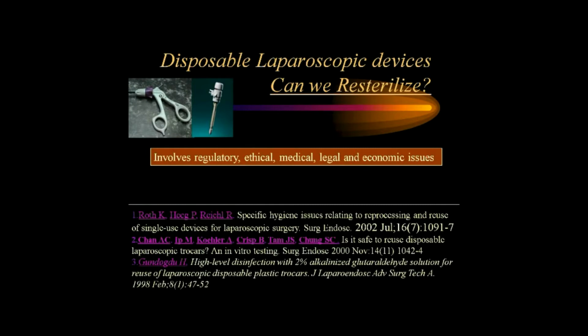Can disposable laparoscopic devices be re-sterilized? It is a $1,000,000 question. The same question has been asked, even relevant to the endoscopic devices or accessories. But we need to realize the regulatory, ethical, medical, legal, economic issues in this one.